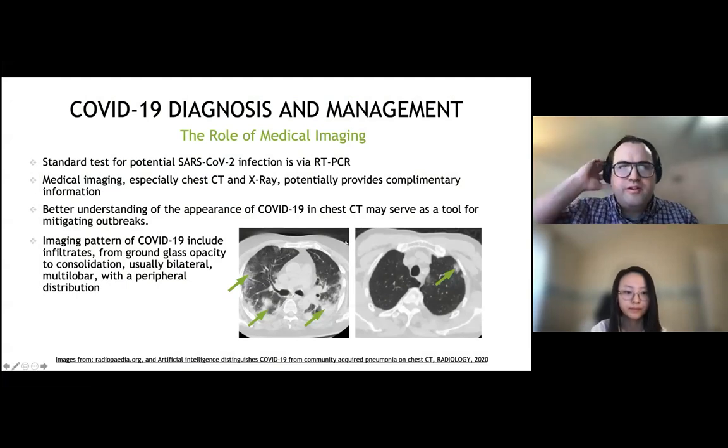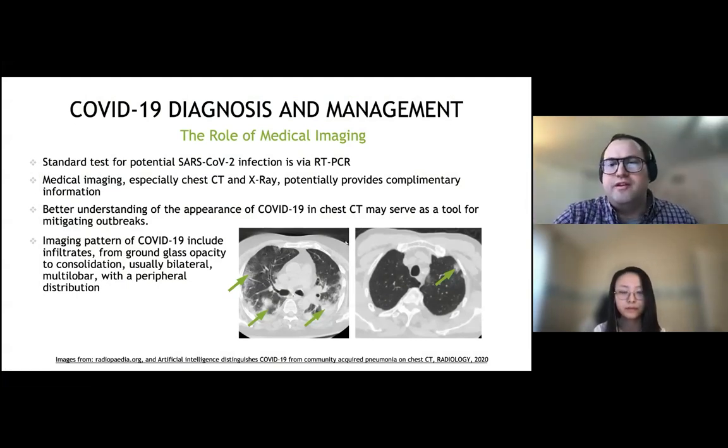So for COVID-19 diagnosis, what role can medical imaging play? By now, I think everyone knows that the gold standard test for SARS-CoV-2 infection is the PCR test, but medical imaging can play an important role to provide further information about the current disease status, for example, or patient management and triaging of patients in the hospital system.